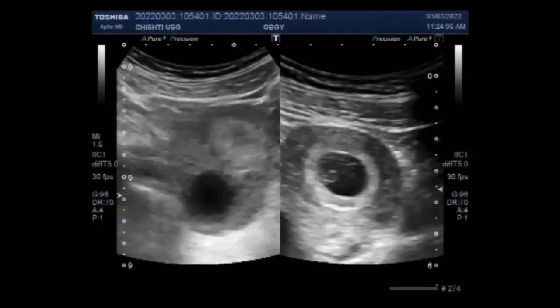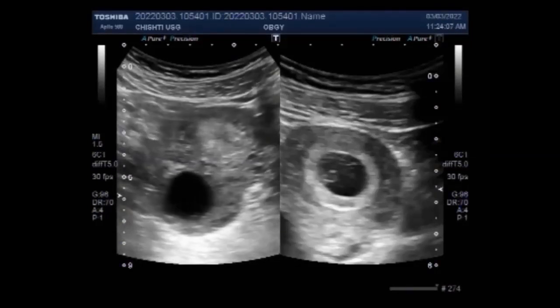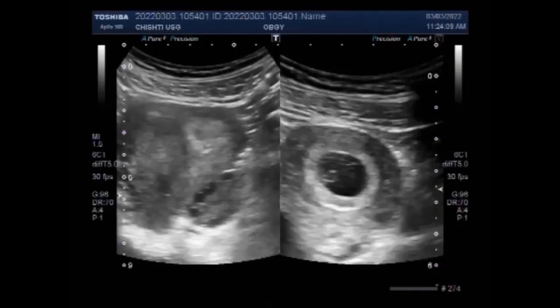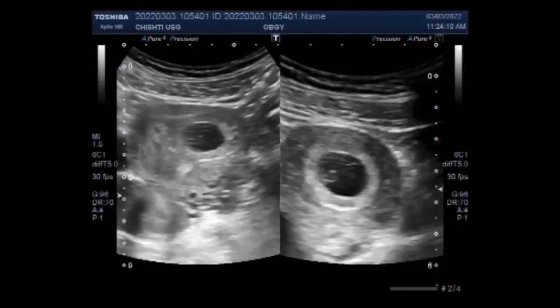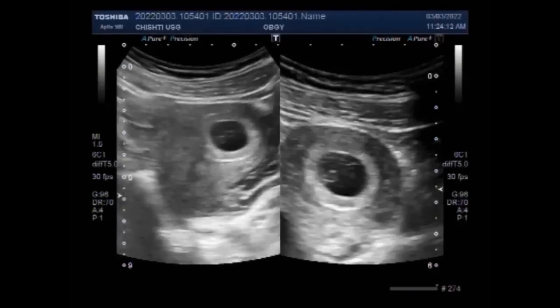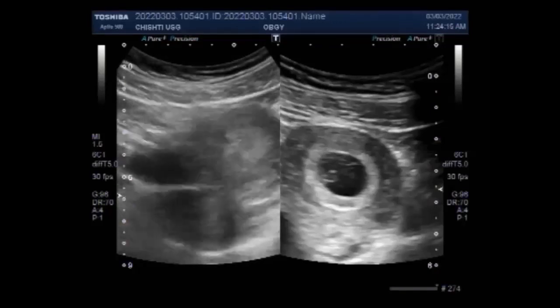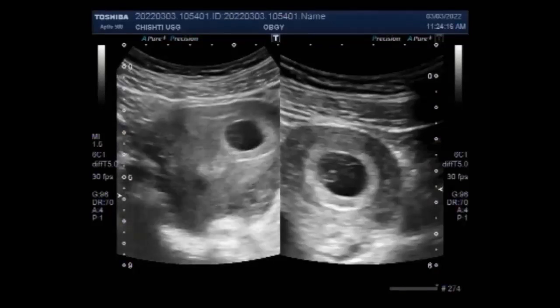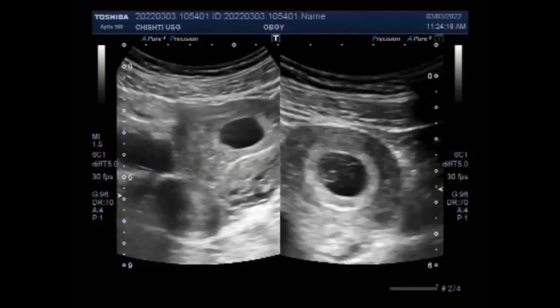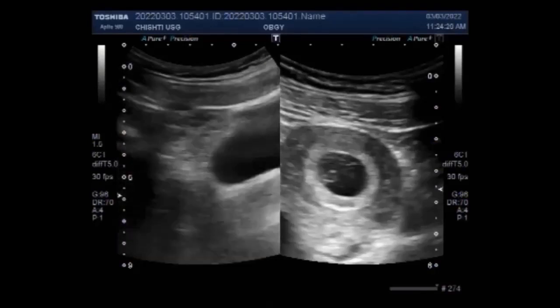Now you can see simultaneously the existence of the ovarian cysts along with the early pregnancy. These ovarian cysts are peripheral sacs that form on the ovaries.